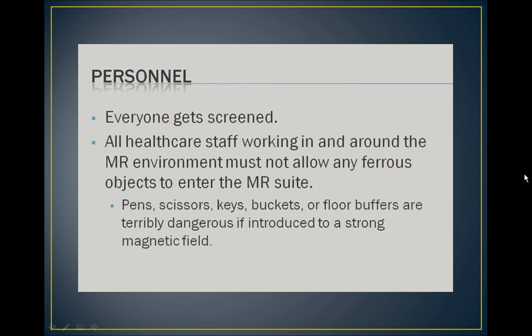All support staff and personnel working in the MRI suite must not have any kind of ferrous implant or contraindicated device. It is our responsibility as the MRI technologist to ensure that no one enters the scan room with any ferrous objects, or that a person that has a contraindicated implant or device enters the room. If ancillary personnel such as an ambulance crew, radiology nurses, or anesthesiologists frequent the area, it is important to have an updated medical consent form filled out by each individual on hand to ensure their continued safety.